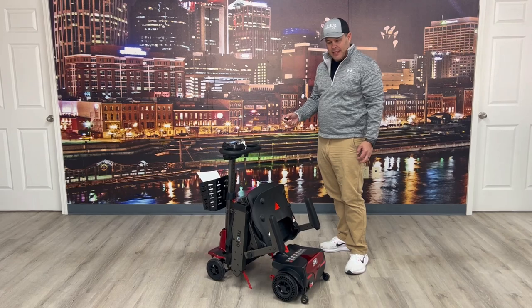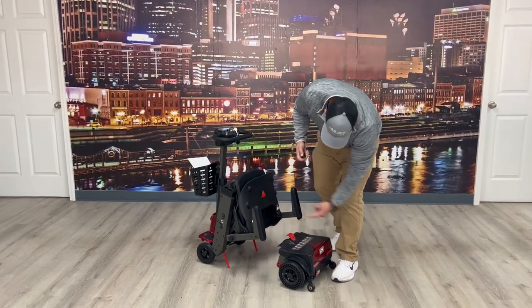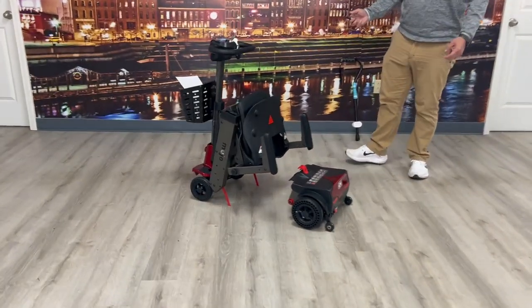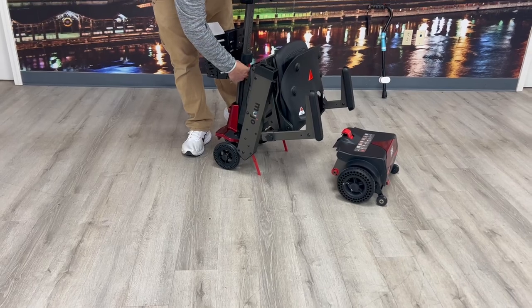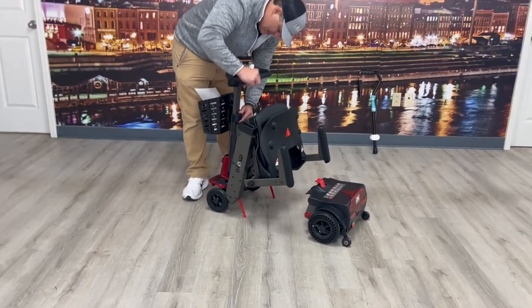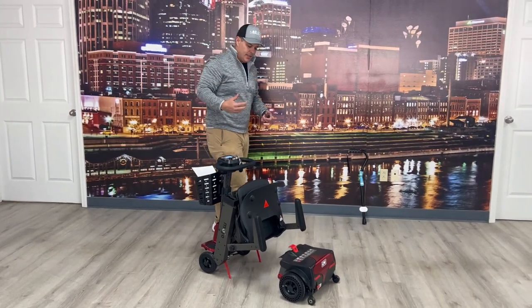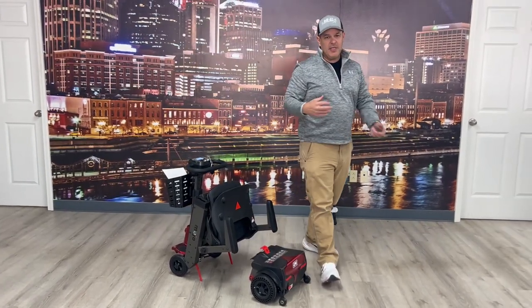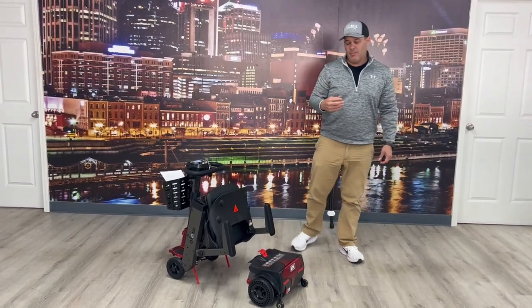It's still balanced — those little red levers allow me to balance it. So I can make this very compact, and the basket will also come off. It actually folds up, so you've got something where the heaviest piece is only 38 pounds, which makes it one of the lighter mobility scooters on the market.